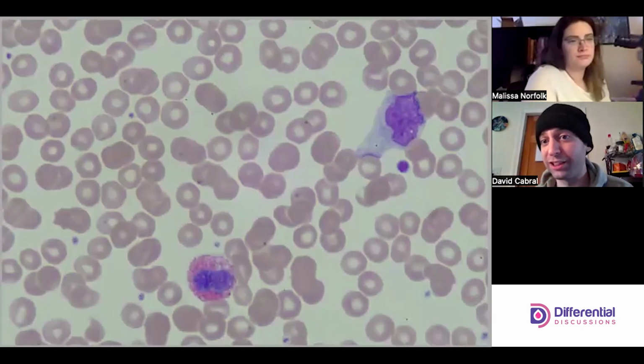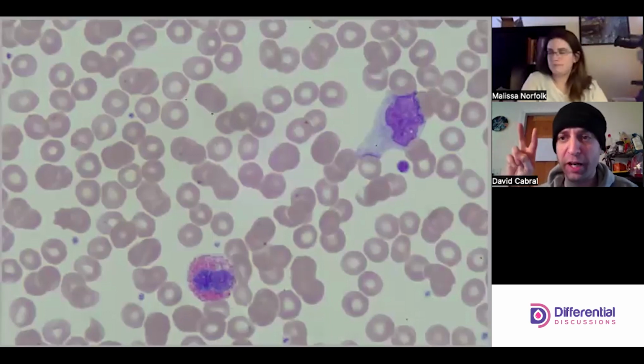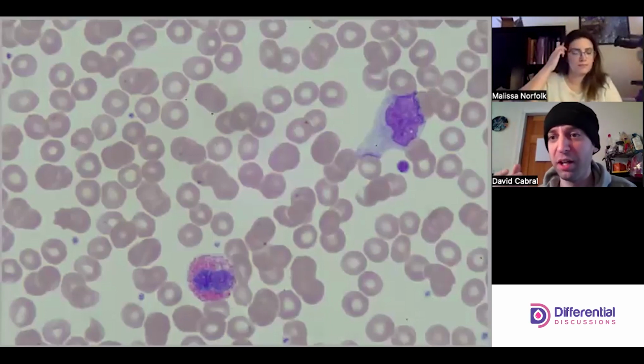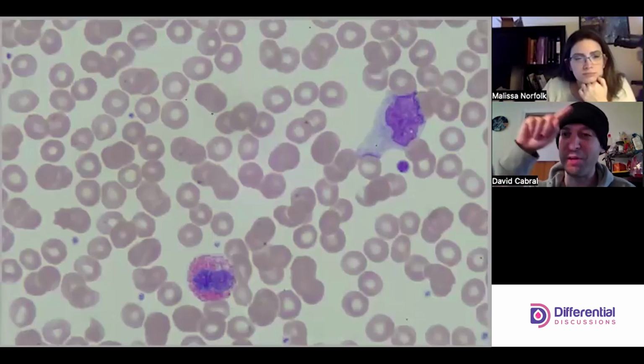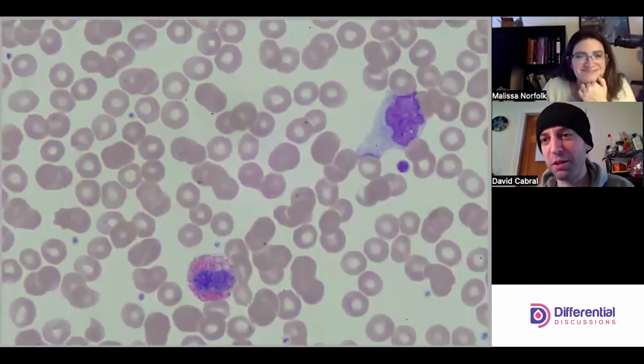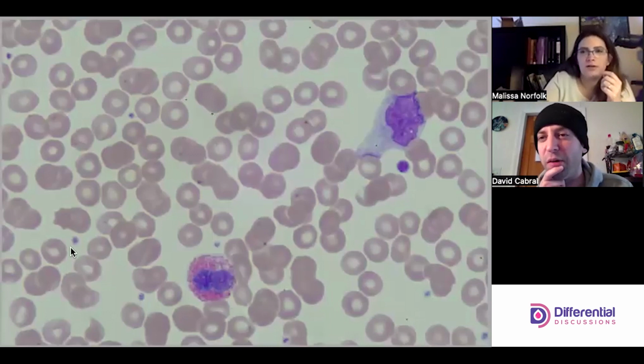So the other thing I'm looking at is what the rest of the cytoplasm is doing, and it's got the bluish gray kind of boring, quote unquote. I don't think monos are boring, but more boring than a lymphocyte. I'm also looking at the nucleus contour. So this one has what you might say irregular contours, but given the chromatin pattern that's consistent with a mono. This is exactly what I would expect. There's a nice amount of grit and texture to the cytoplasm. So yeah, I'd go mono. And also where it's touching and grabbing a red cell here, it's not even darker colored. Yep.